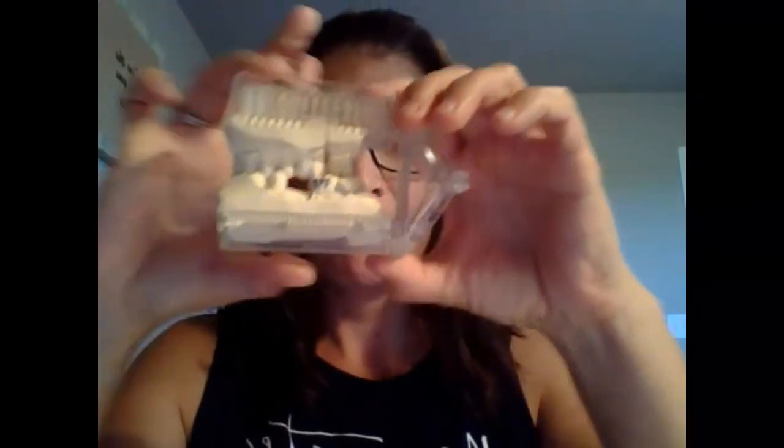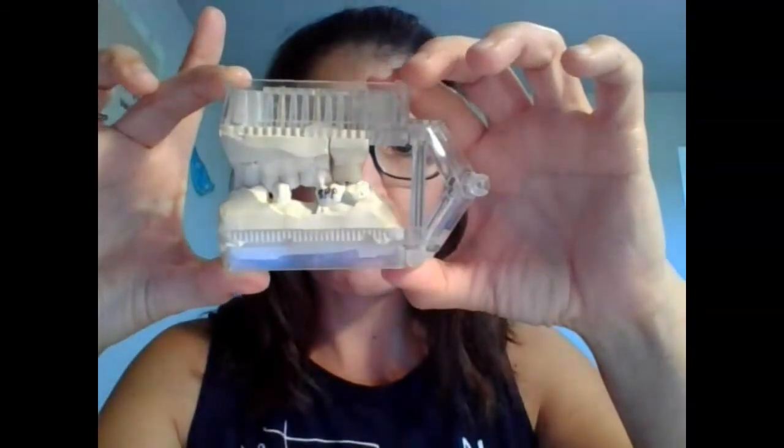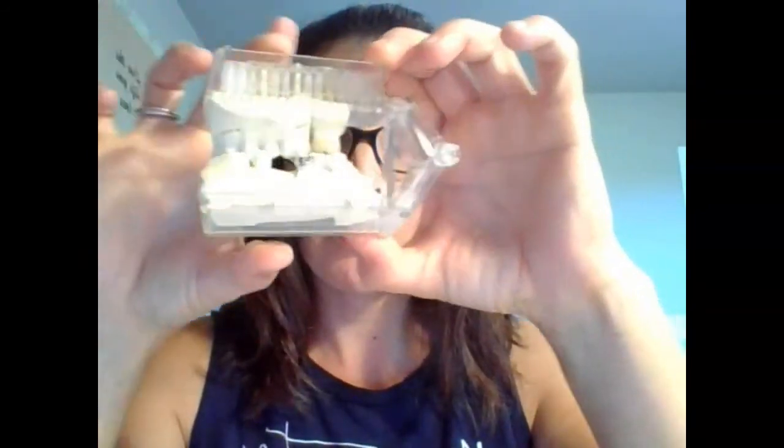And then they may also place it back onto the articulated model here, and then occlude it on there so they can see how it looks both interproximally and also occlusally. And then once they do that, they try it into the mouth.